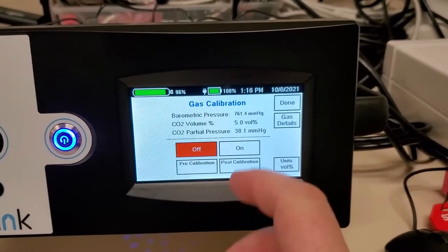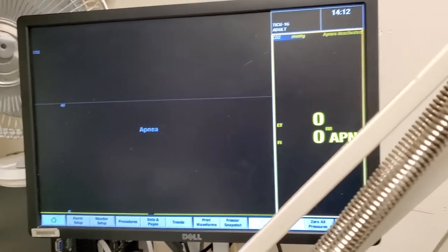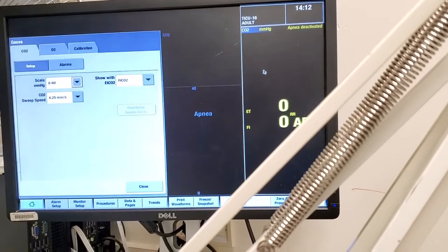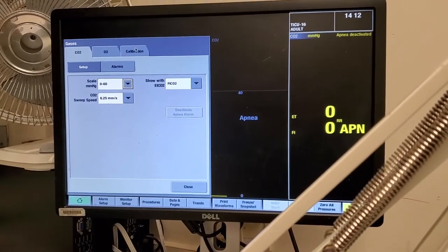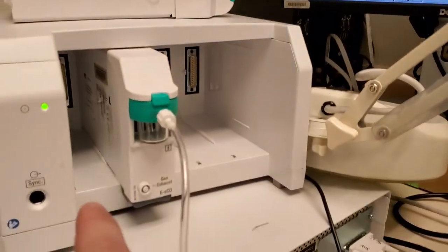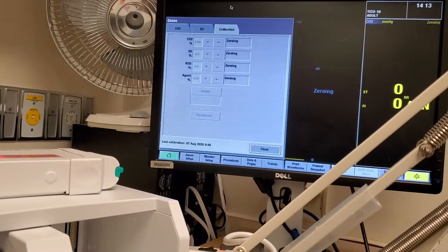We have several options here. See this one? It's ready and waiting. You see the yellow on the right-hand side? That is the module — it's been recognized. We're going to click on it, click on the calibration tab, and you can see it is zeroing the module currently.